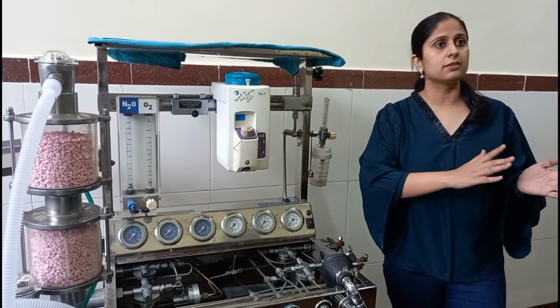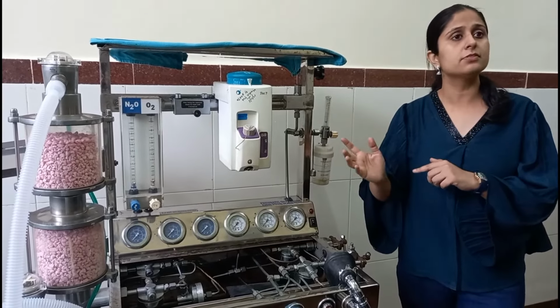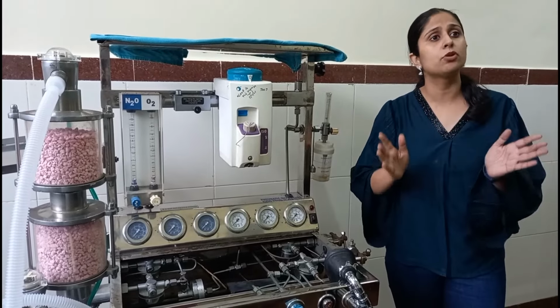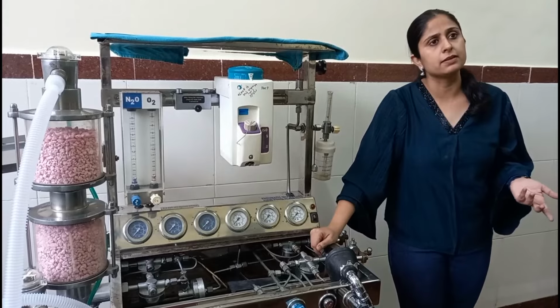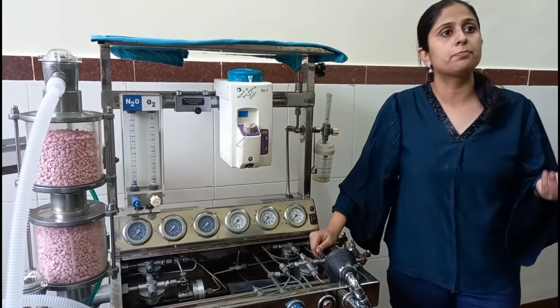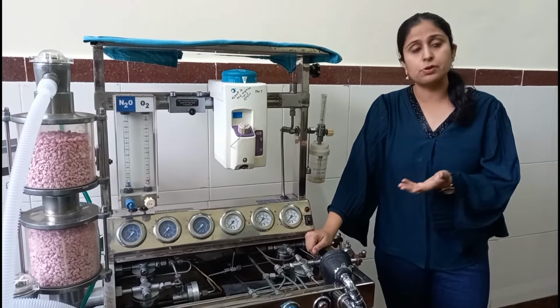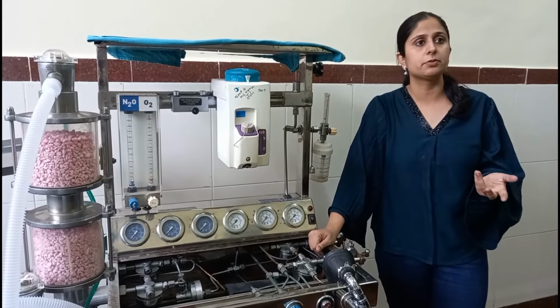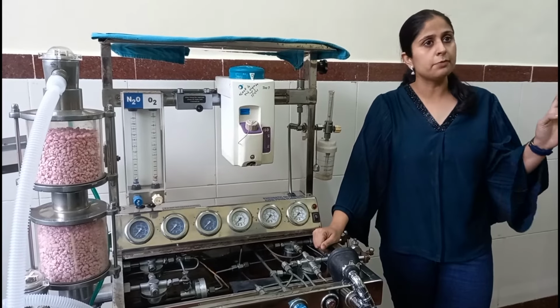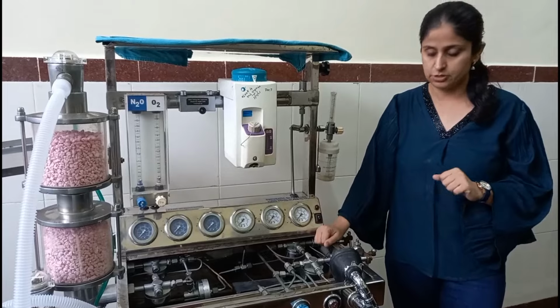Apart from these three things in the high pressure system and these 5 things in the low pressure system, everything else belongs to the intermediate pressure system. So if someone asks you whether the pipeline is intermediate, it is intermediate. Pipeline inlet connections are intermediate. The flush valve is intermediate. Anything else, like the secondary stage pressure regulator, everything will be intermediate. So just 3 things in the high pressure, 5 things in the low pressure, and the rest everything is the intermediate pressure system.